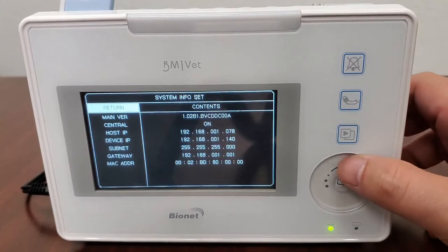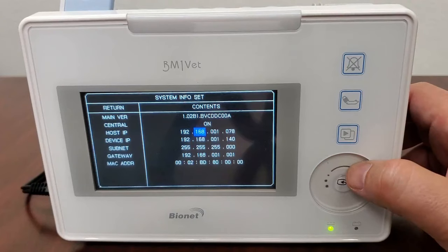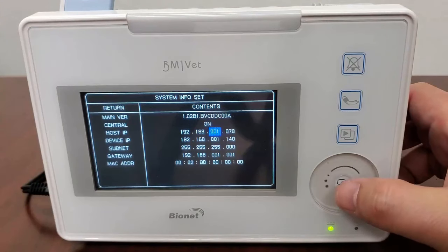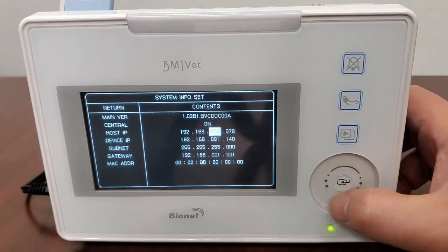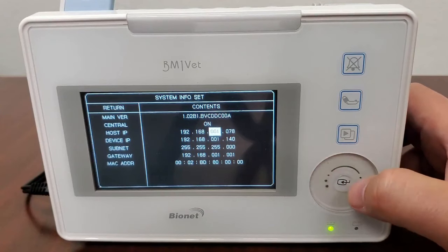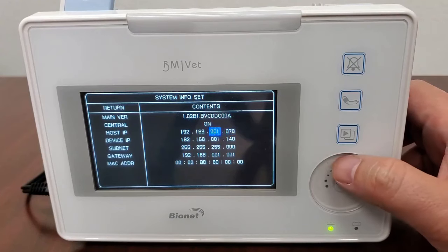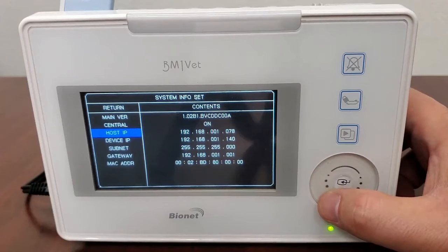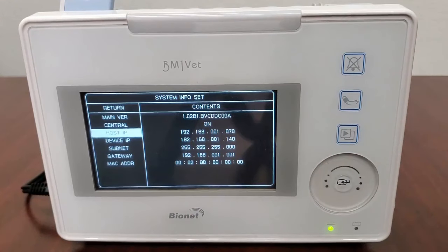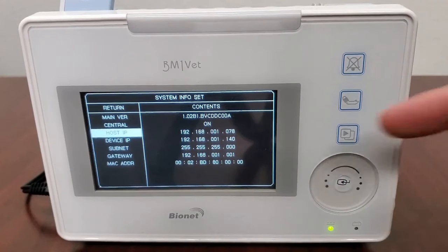Wheel over to Host IP, hit Select, and wheel right to the IP address sections. Input the IP address from your computer by highlighting each section of numbers, pressing Select, and then using the touch wheel until you reach the correct number. When the correct number is reached, hit the Select key and repeat for each section until your computer's full IP address is input. Wheel over to Host IP and hit Select to rejoin the main menu on this screen. You will need to follow this method for inputting the remaining network data, as the BM1 VET requires manual input of networking data.